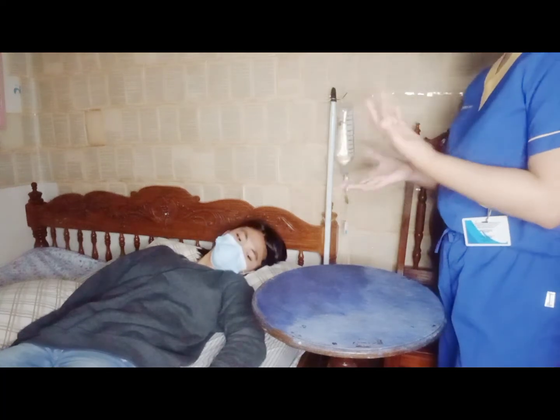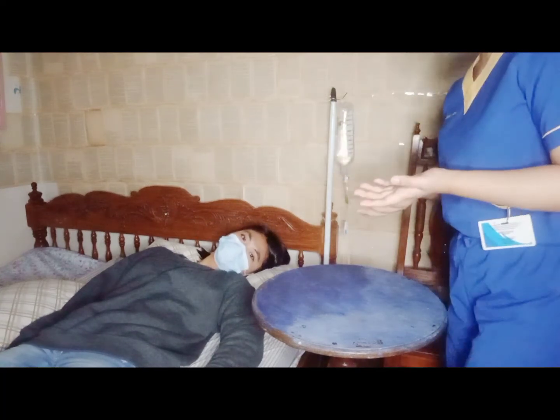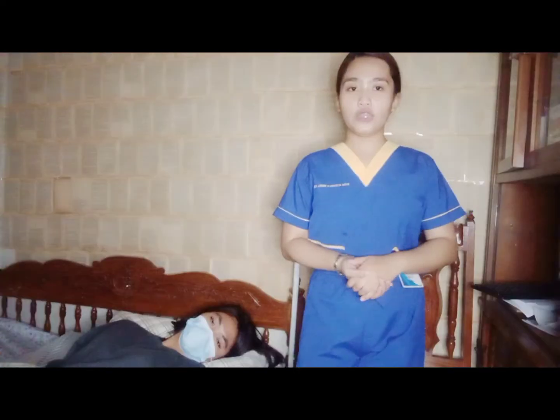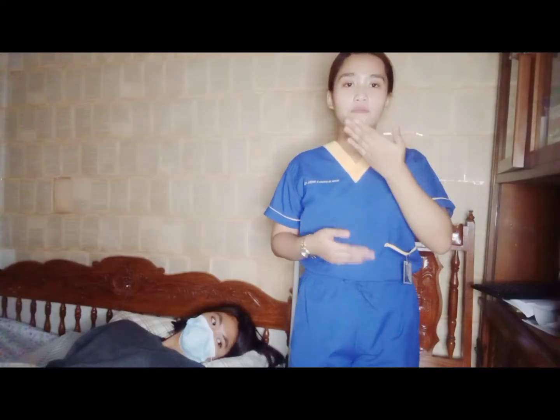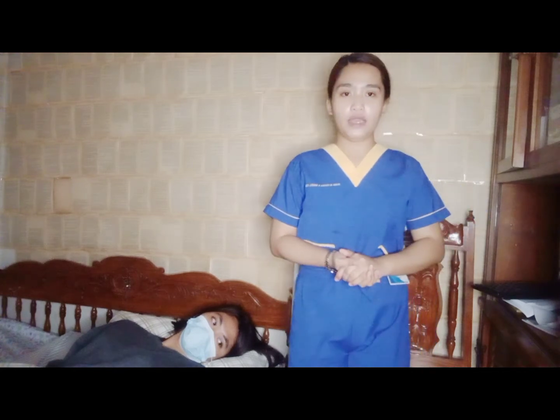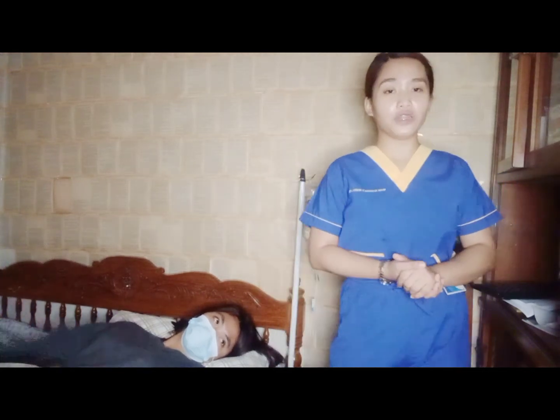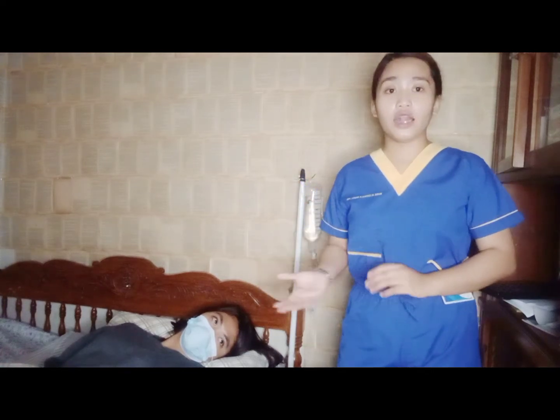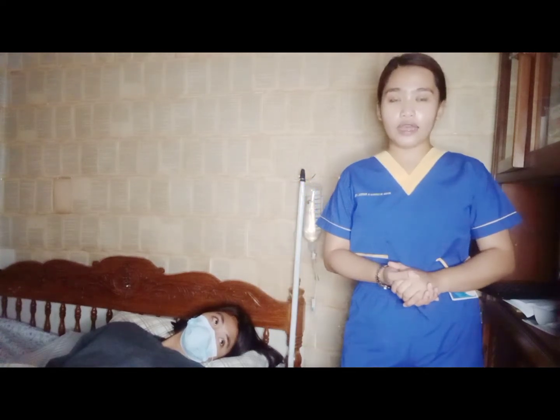And also, huhugas ako ng kamay, okay? Po, ma'am. So, assume that I'm done washing my hands and I already removed my face mask or the PPE. Now, let's return to the patient's room. So, we need to return to the patient's room after 30 minutes or return early to check on the patient.